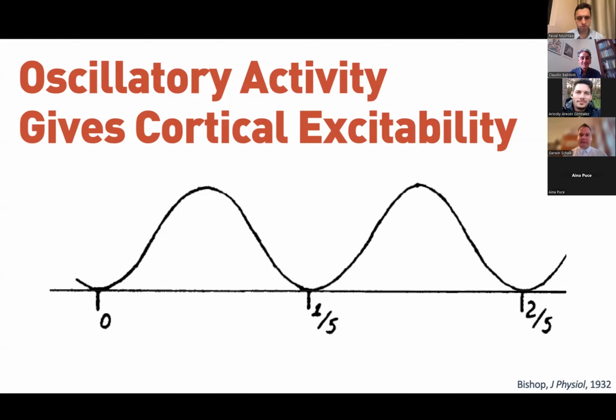There are several papers that we published on this topic, showing that using an appropriate measurement of amplitude gives much better prediction of cortical excitability than either the power or the phase. But this is one signal that we can see with electrocorticography, just like we can see it in scalp recorded EEG, and what it really means physiologically is cortical excitability: how easy is it for an external stimulus or some other brain area to excite a particular area in the brain?